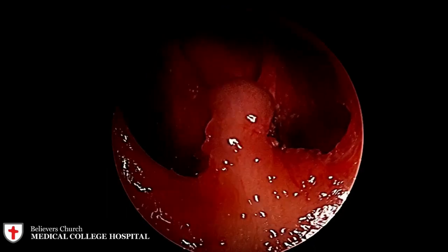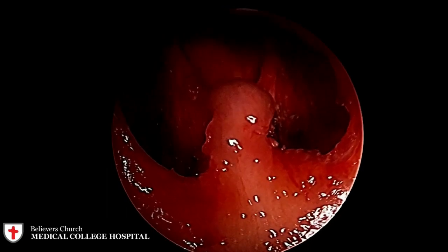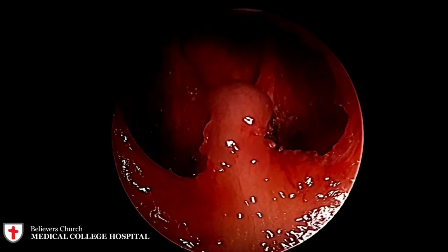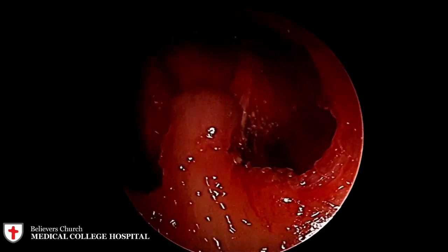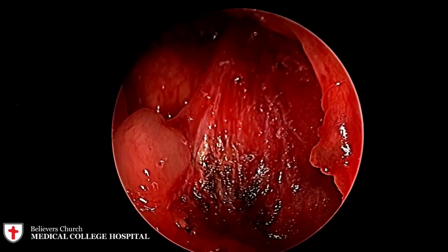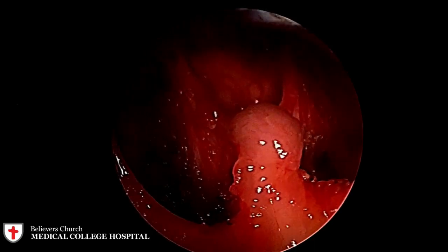After the surgery, the fossa should be thoroughly inspected for any bleeding points and hemostasis should be achieved before the patient recovers from general anesthesia.